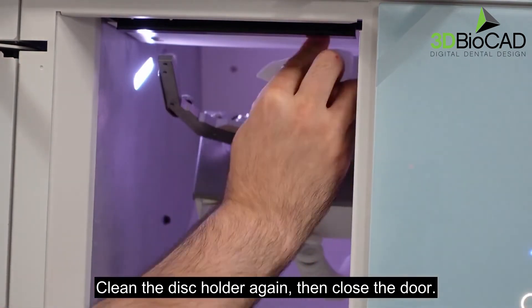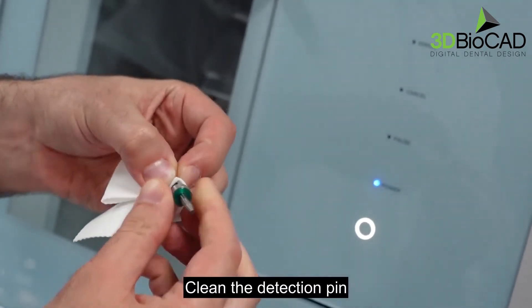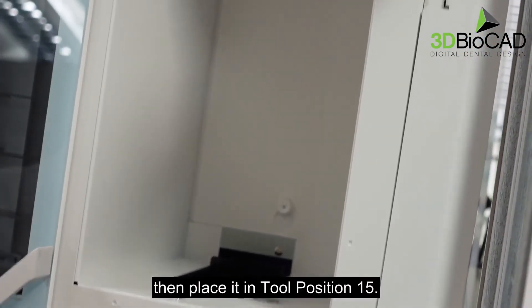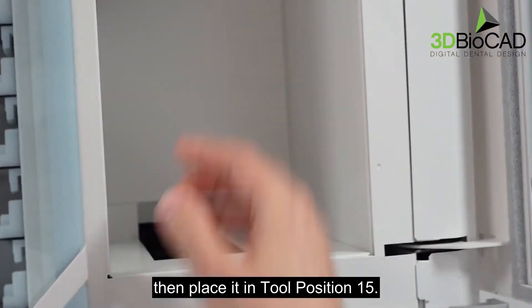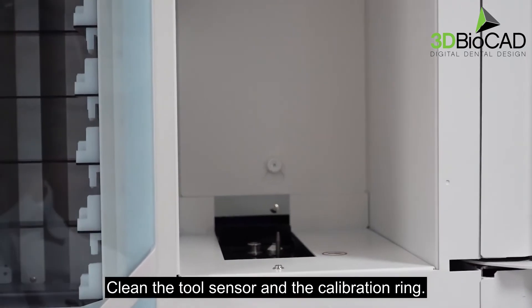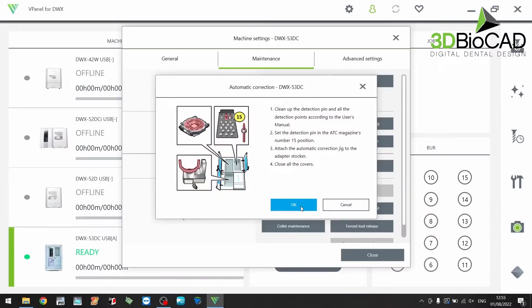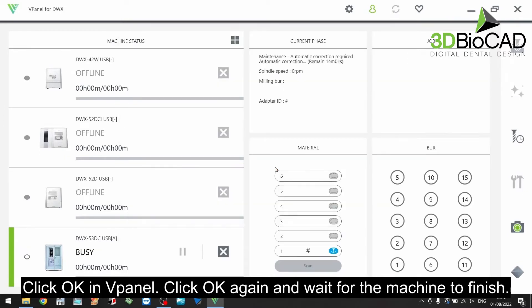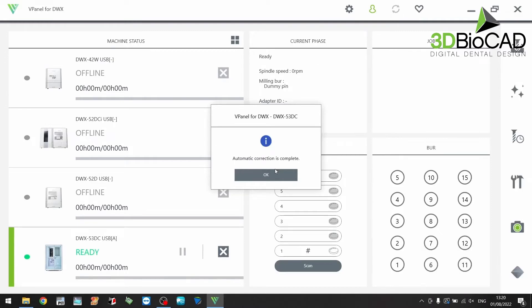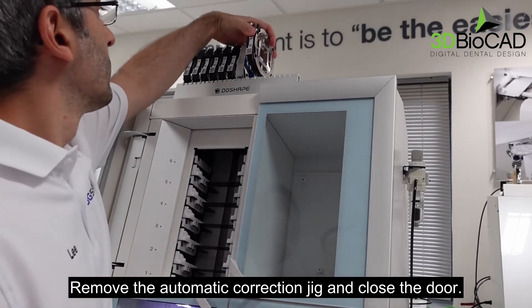Close the door. Clean the disk holder again and clean the detection pin, then place it in tool position 15. Clean the tool sensor and the calibration ring. Click OK in v-panel, click OK again and wait for the machine to finish. Click OK in v-panel. Remove the automatic correction jig and close the door.